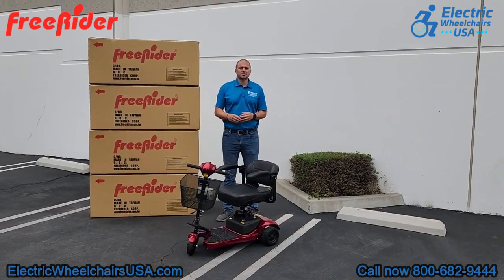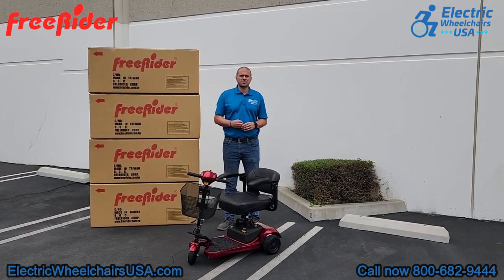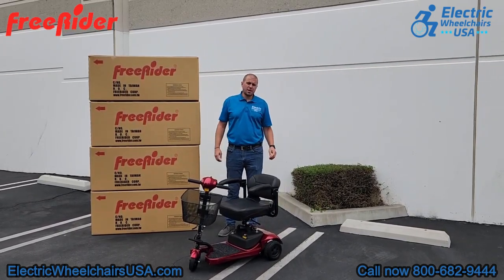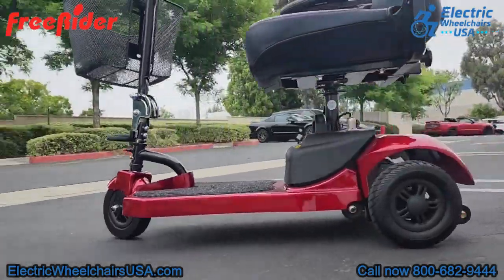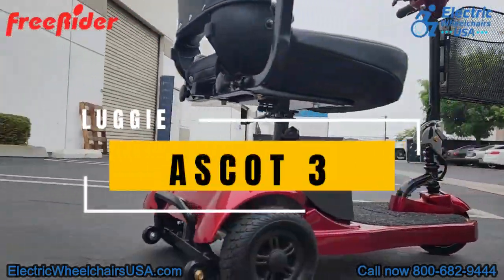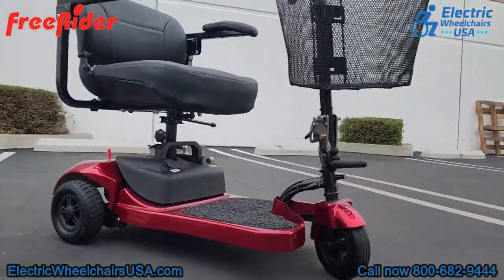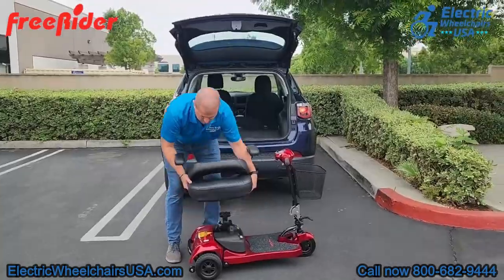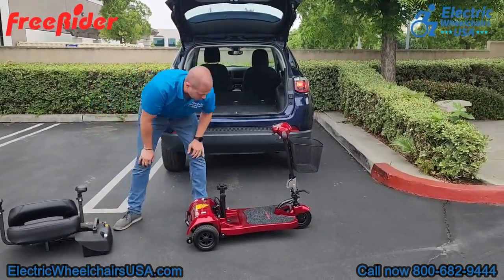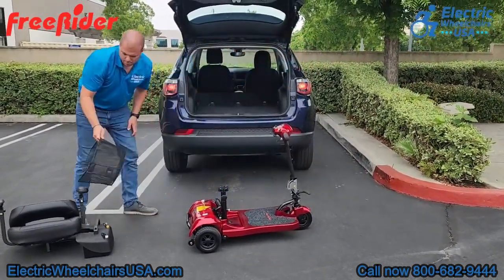Welcome to the Electric Wheelchairs USA Mobility Experts channel. We're at Freerider's corporate headquarters and in today's video we're going to go over the Ascot 3. This is a portable three-wheel mobility scooter that is more affordable. It can be broken down into five more easy-to-manage pieces without the use of tools, and also reassembled without the use of tools.